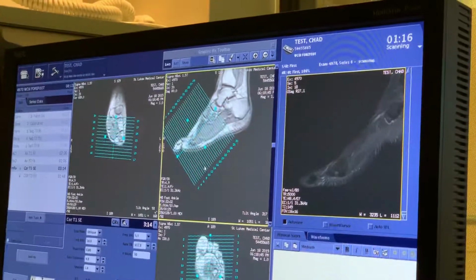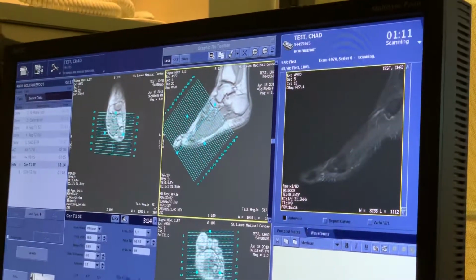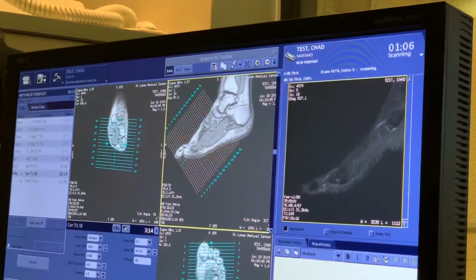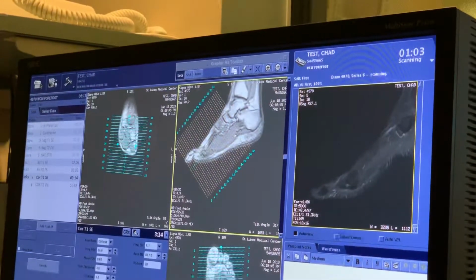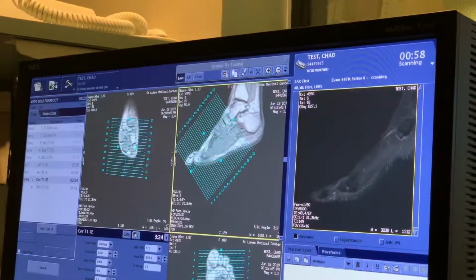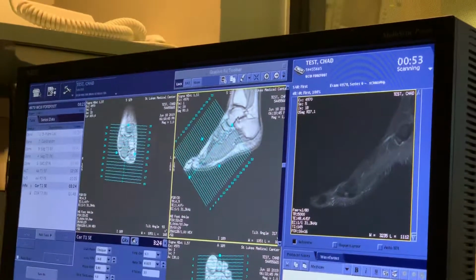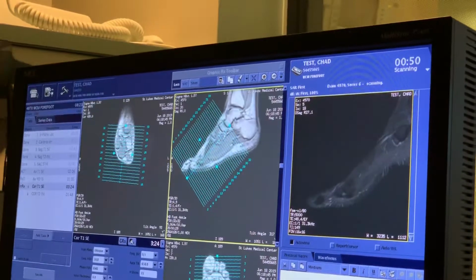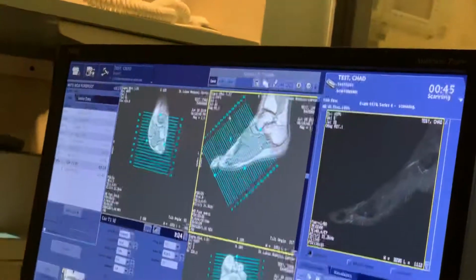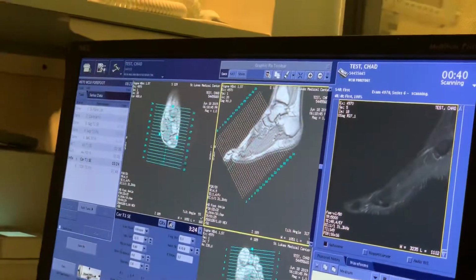Now, there's also the question as to how far you go for a forefoot. I tend to be a little generous with this. I quite often will go right to and maybe a slice into the talus like this. This is the talus right here. And then you have the calcaneus, so that you're covering the metatarsals and the distal tarsal bones, right? That's what I do. I've seen techs take a forefoot to about there, but I like to be a little bit more generous about it.